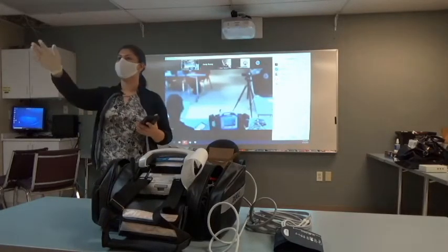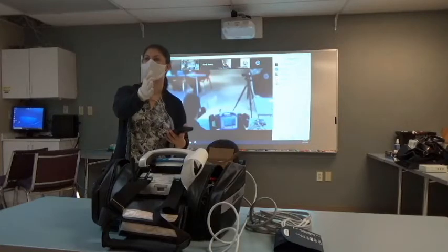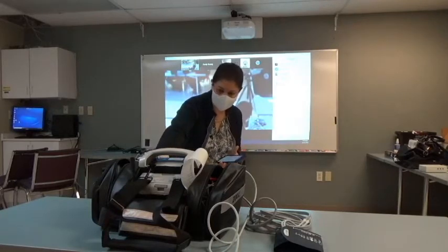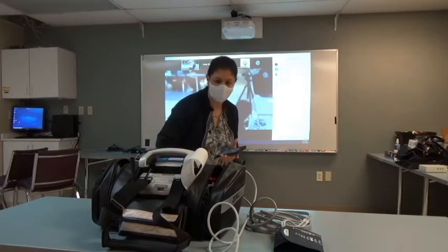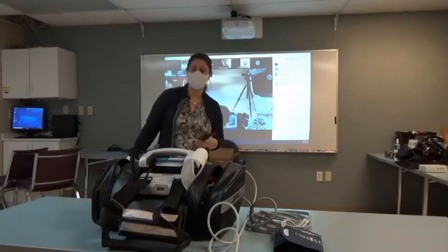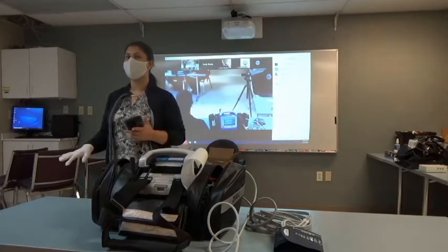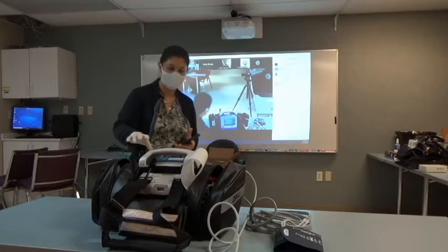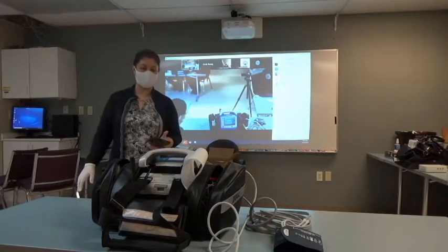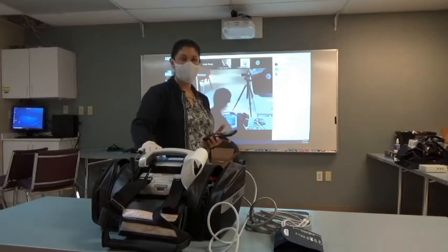All right, we're going to move in sections so that we can all get the 12 lead transmission. I'm going to start with the left side of the room first, and then we'll get you on the right hand side. The first thing we're going to do is go down to the 12 with the envelope. You're going to pull up a list of the hospitals. Not all of them are in there just yet, but we're going to find the word test. Go down with your arrow until you find the word test. Press the enter key, and this is just for the left side of the room right now. Then go down to transmit.